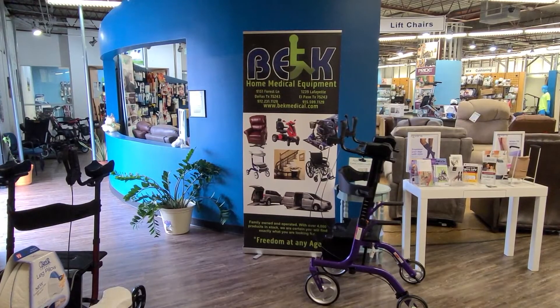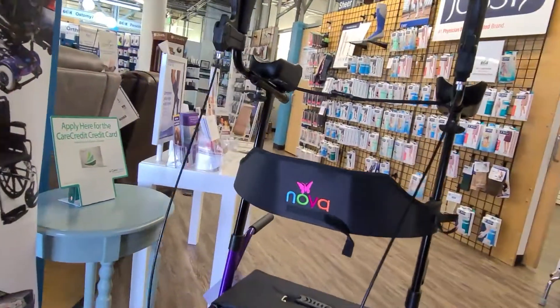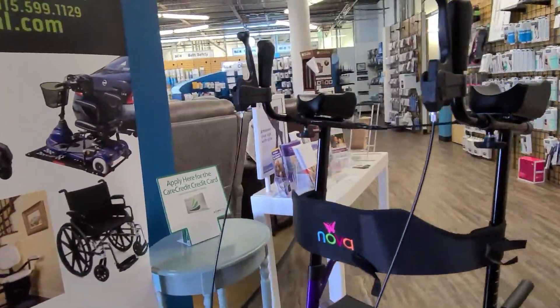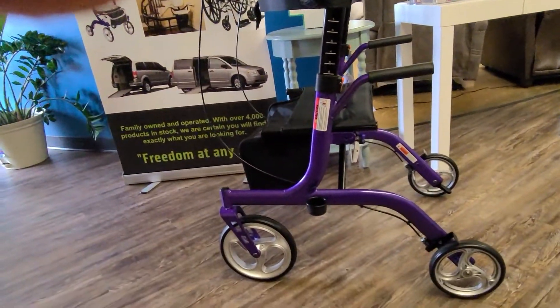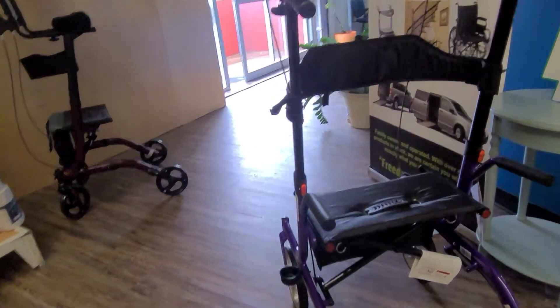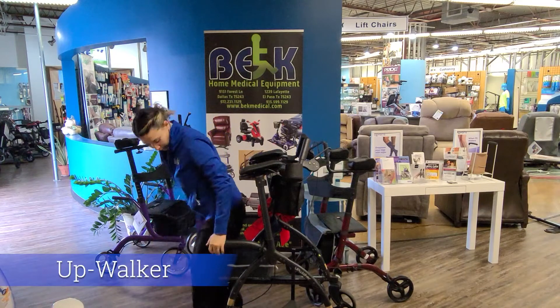Our second upright walker is going to be the Phoenix, which is made by Nova. This one does come in different colors — people always ask us that, this is the one that you can choose your colors on. It's going to be very similar to the Upwalker with a better price point for those of you who are concerned. It does have a seat so you can sit down and take a break. This is the Phoenix by Nova.